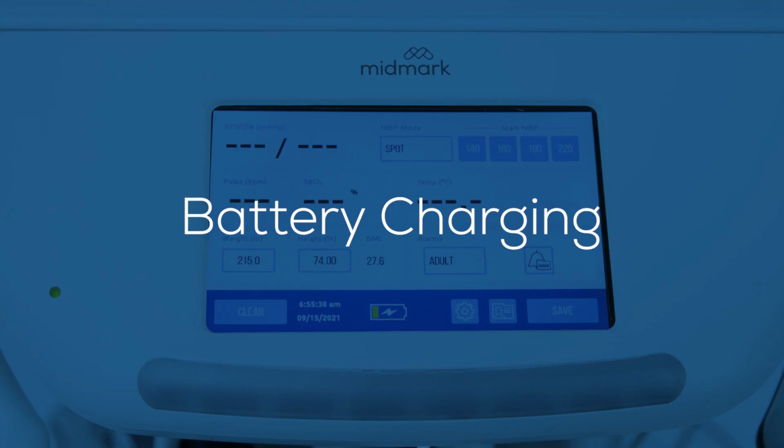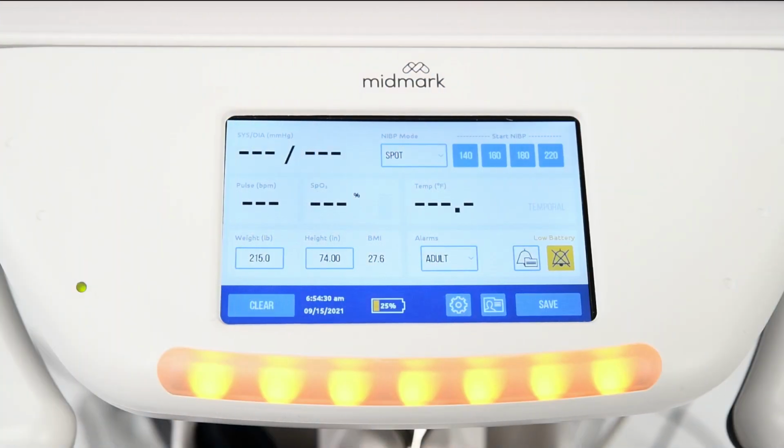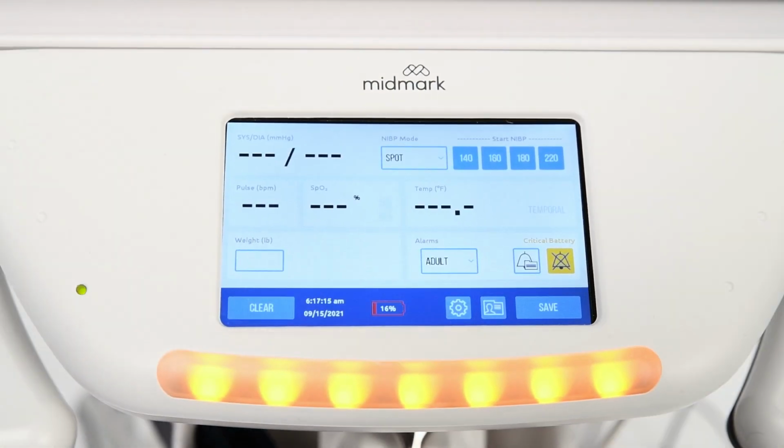Battery charging. When the battery is charging, a lightning bolt icon appears over the battery icon. If the unit is running on battery power, the battery charge level will be indicated by the battery icon color. When the battery drops below 40% or 20% remaining power, the device will activate a low-level alarm.